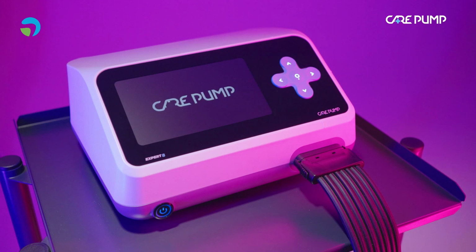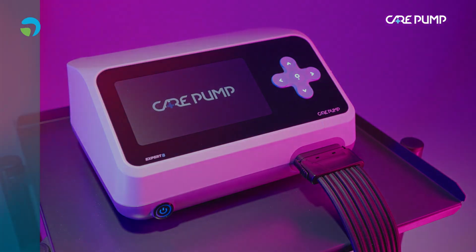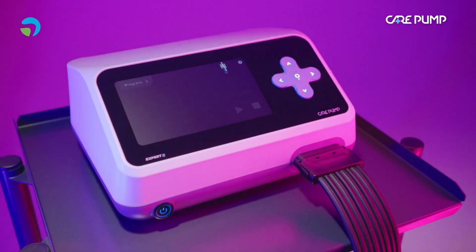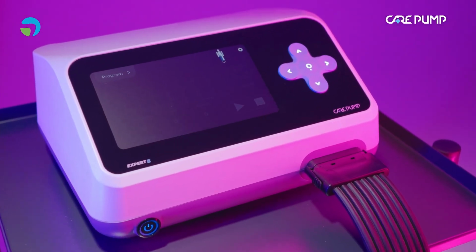You can start the treatment in two ways, by using the touchscreen or the keyboard. Starting the treatment on the touchscreen. Start by selecting a treatment program. Until the program is selected, the possibility to set other treatment parameters will be disabled.